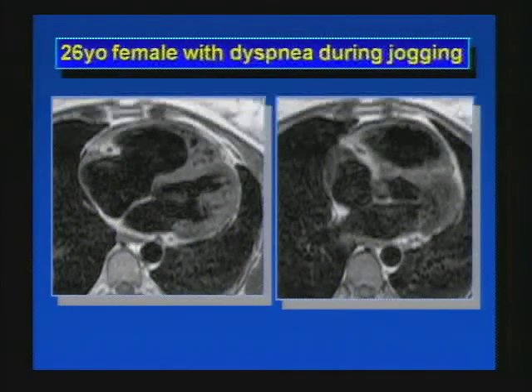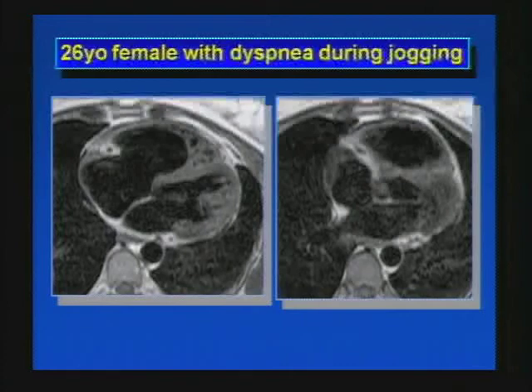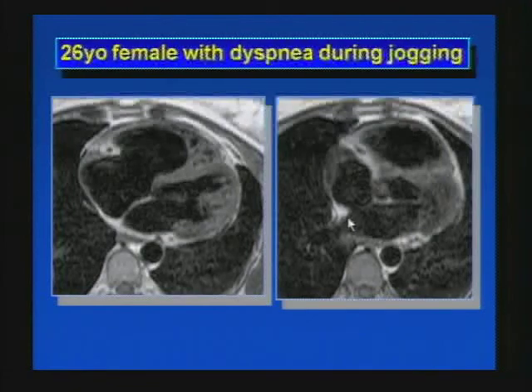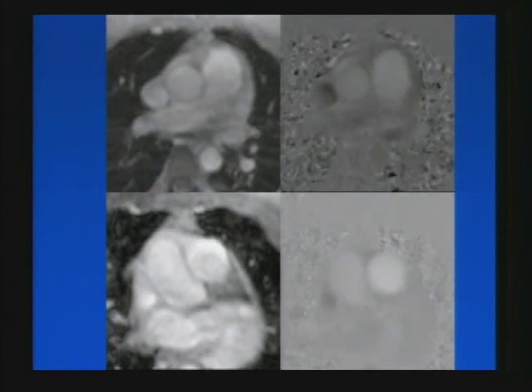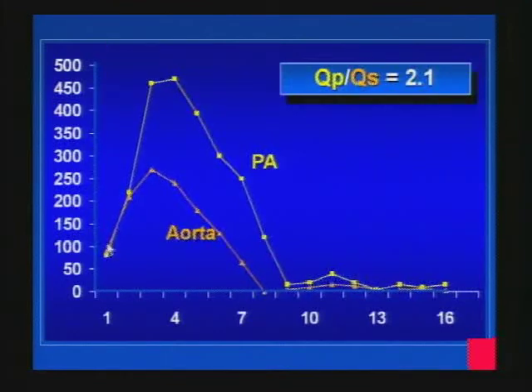Next case: 26-year-old with dyspnea during jogging. The first thing that calls attention is the enlargement of the right ventricle, suggesting a left-to-right shunt. Looking at the atrial septum, we see a defect — this is a secundum type ASD, the most common type, clearly seen on cardiac MRI. MRI can also estimate the systemic to pulmonary flow ratio by measuring blood flow in the ascending aorta and pulmonary artery using velocity-encoded cine imaging. A flow versus time curve shows the pulmonary to systemic flow ratio is 2.1 — a very significant shunt.